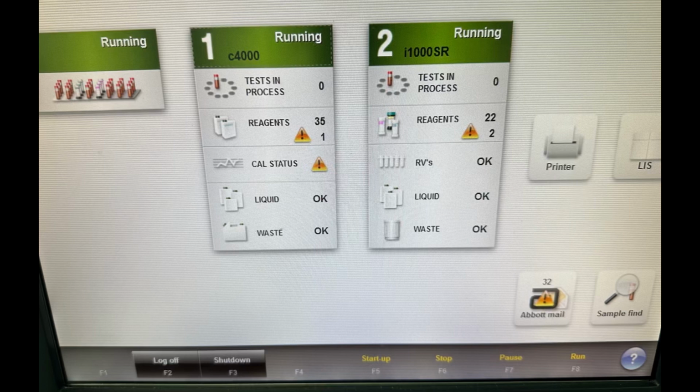And the first column is for the sample holder. It also should be working freely and easily, so that it will carry the samples to the scanner, then to the machine where the samples get aspirated, and again it will bring the samples back to the same position where you have put them. This is how the sample holder will work.